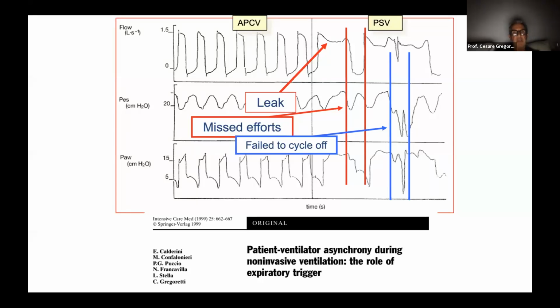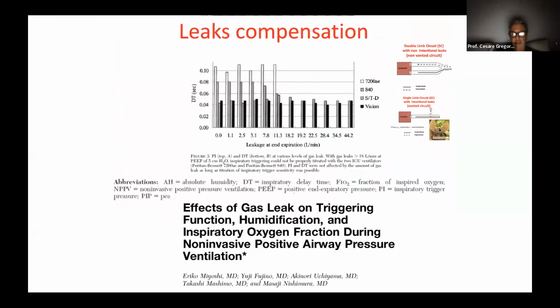We were lucky because time passed by. Now on ICU ventilators and in most home care ventilators, we have compensation for leaks during double circuit or non-vented configuration.